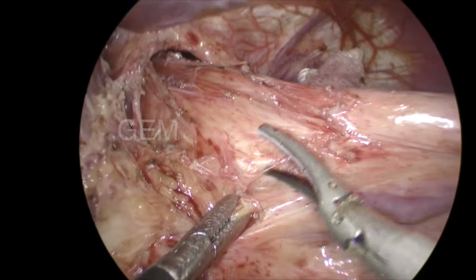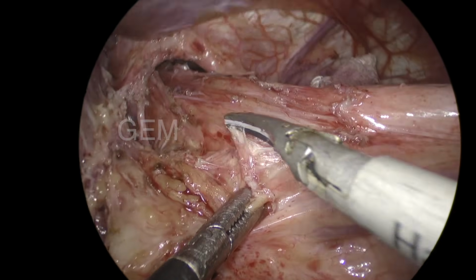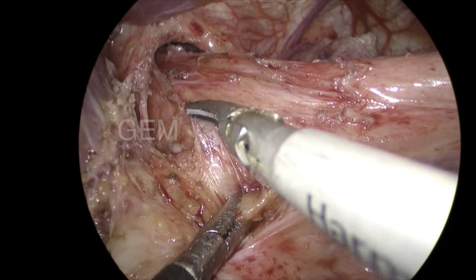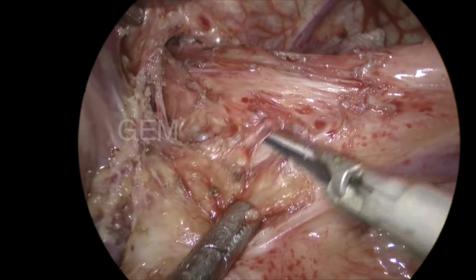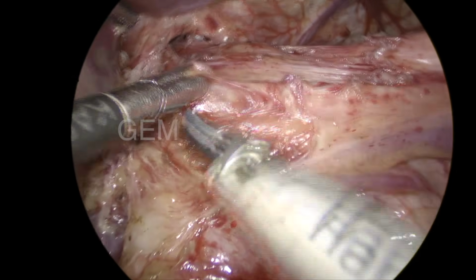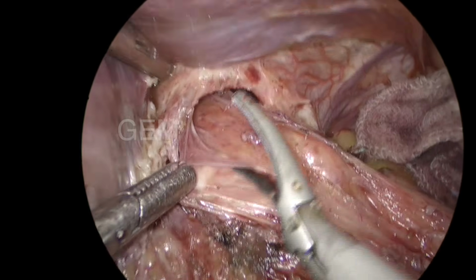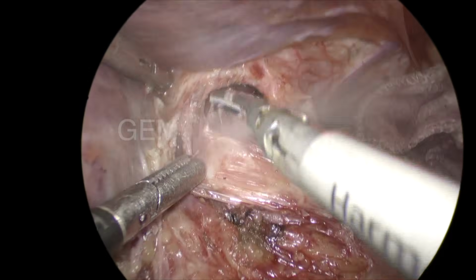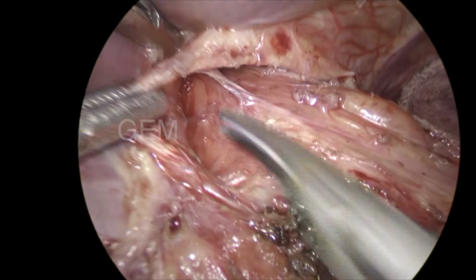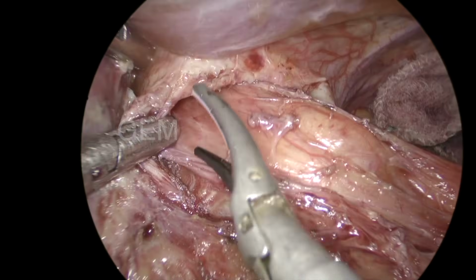I will divide it, otherwise I won't divide. Slowly I am going on the right lateral side of the esophagus, and here some thick tissue is there. It may be the fundus, and here again I went a little bit up. See, that is the pleura. I could see the pleura.